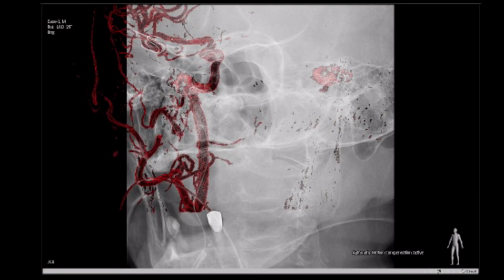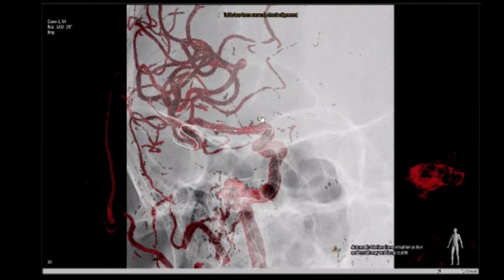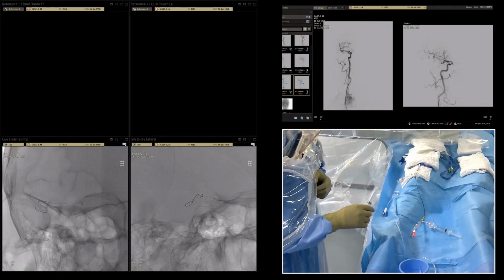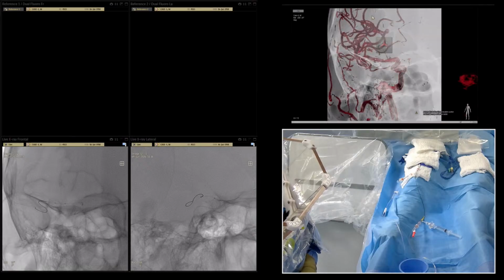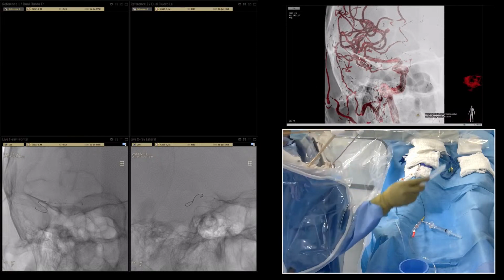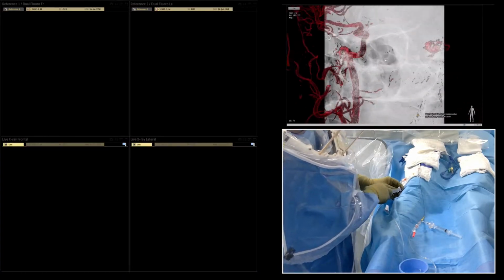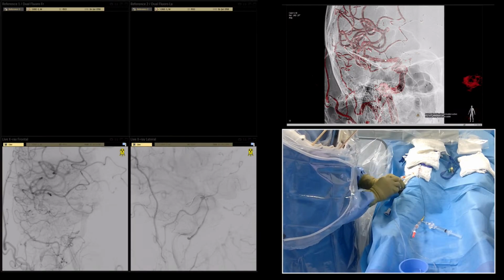Okay. Let's do more zoom. As the problem is, there is no 3D roadmap on the lateral plane, but it's available on AP. And now for the more visibility, you couldn't see the same on YouTube, but on the big screen we have a 3D roadmap. I hope Evgeny can place the 3D roadmap on YouTube. Okay.